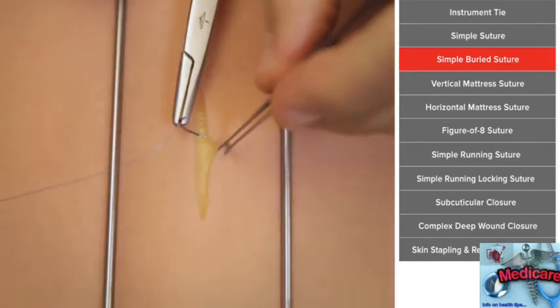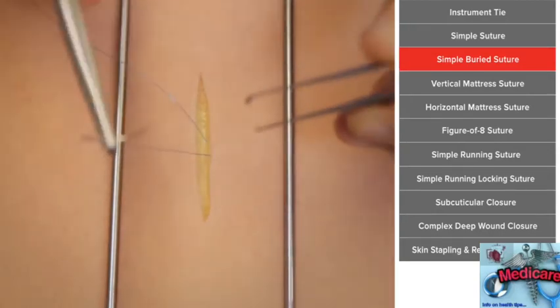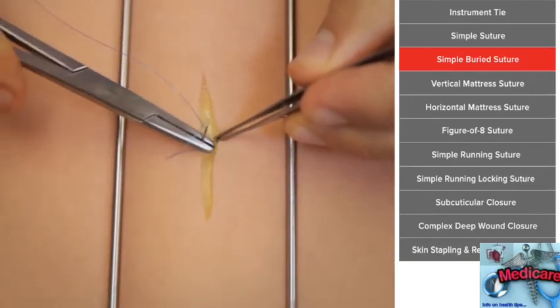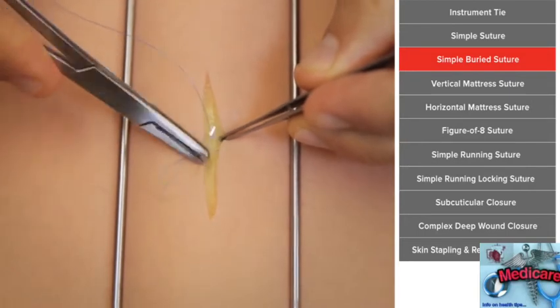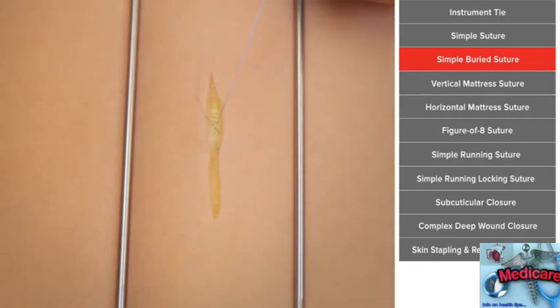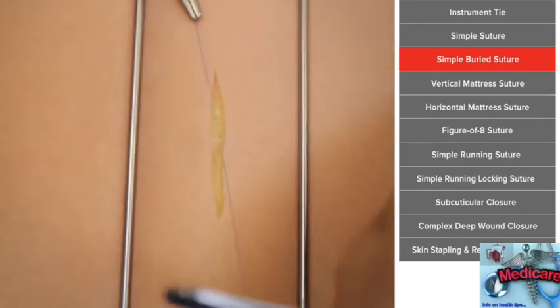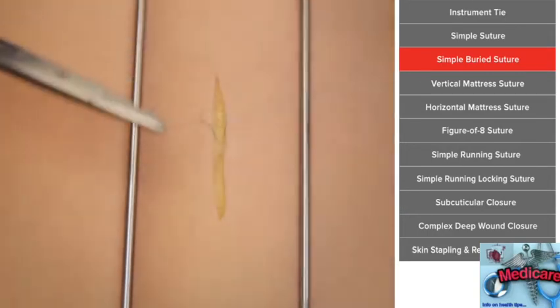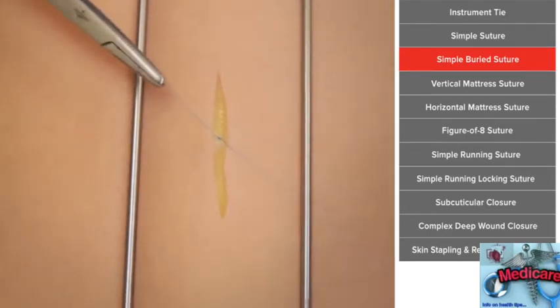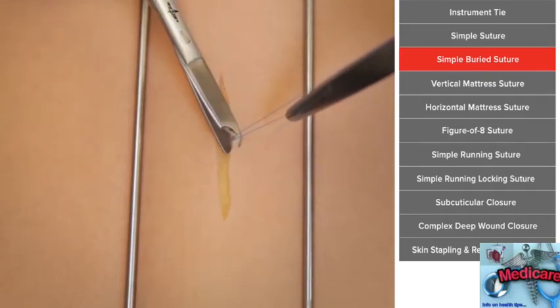So the key here is you want to get some of the deeper tissues, and here you see in the model we can get some of the deeper dermis. There's actually a little piece of mesh in that deep dermis. So we want to grab that deeper stuff, come out superficially, so we're starting deep, and then we enter superficially and end deep. So both threads of the suture are now deep. And what that's going to do when we tie this now is it's going to pull everything together, but the knot itself is actually going to be underneath.